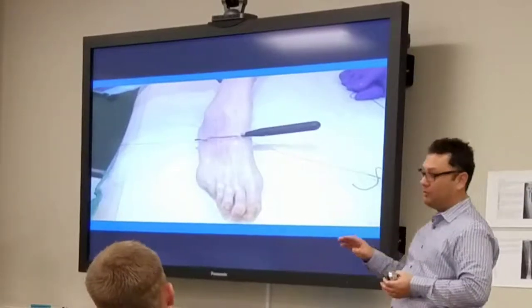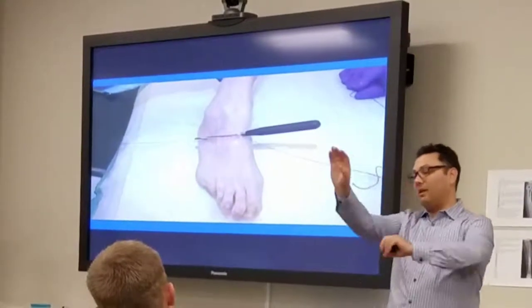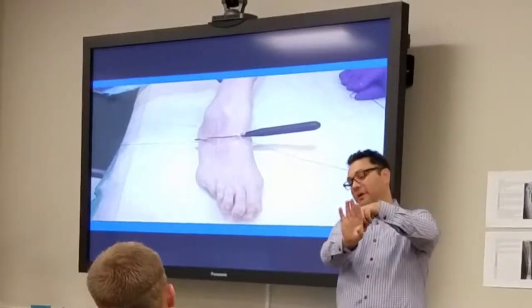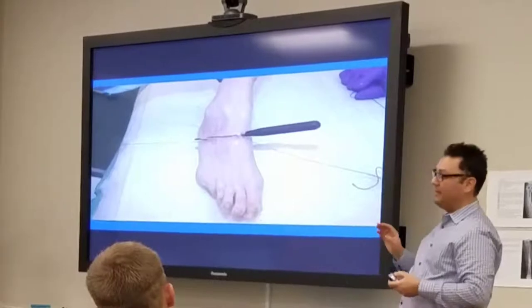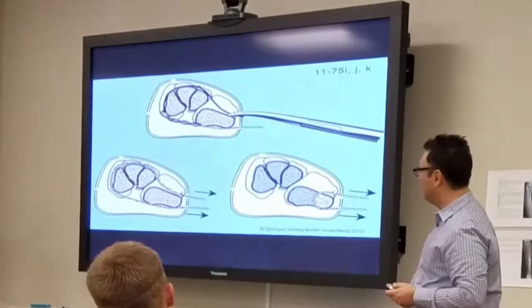Instead of getting that top to bottom pass, instead of worrying about getting around the structures. And typically, with the Charcot foot, that foot is a lot of times abducted over, and there's just a lot of flesh over there, and that fifth metatarsal head is almost touching the calcaneus. And it makes it much harder to pass the Gigli saw that way.